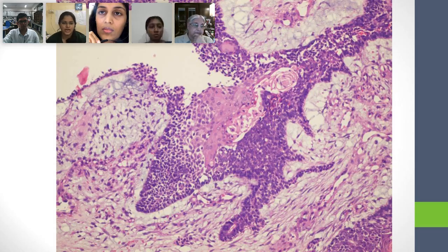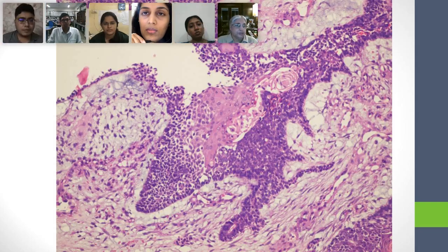Because the cells at the edge are parallel to each other and perpendicular to the surface. So there is a surface, and this is the basement membrane. And then these cells are all columnar, and they're parallel to each other, but they're perpendicular to the surface. You can use that word palisade for many things, including palisades in spindle cell tumors, where you have a bundle that is running, and all of the nuclei are parallel to one another, but perpendicular to the direction in which that bundle is running. Very good. And also you have these little cords of cells that seem to protrude from the basement membrane.